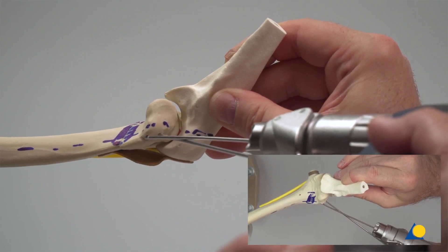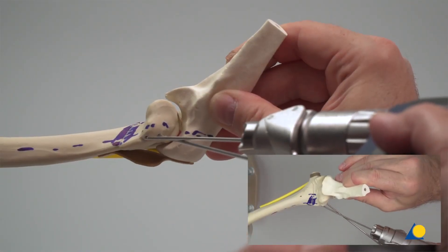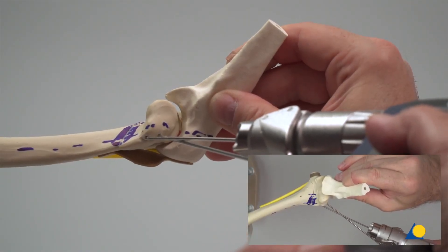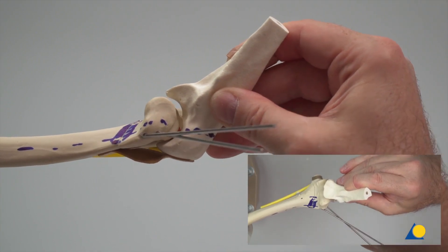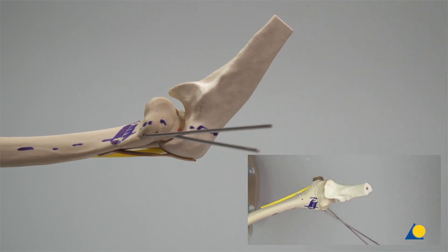Note that it is crucial that the K-wires protrude no more than 2 to 3 mm out of the cortex. Observe that the final radial monolateral divergent fixation is stable.